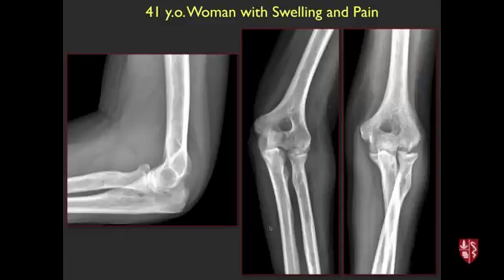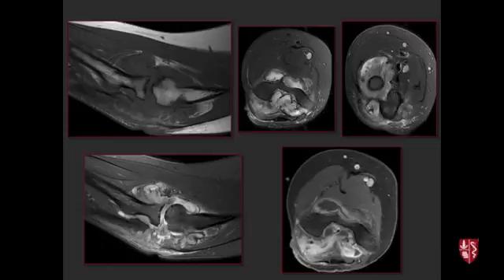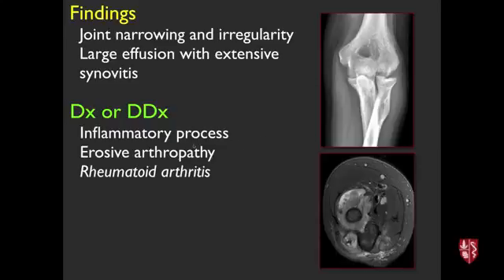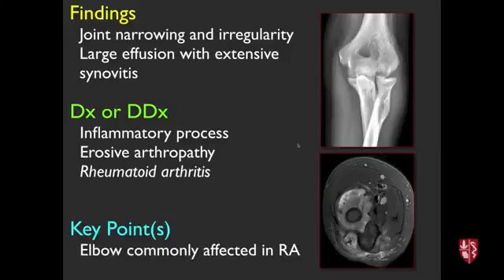Next case, 41-year-old with swelling and pain in the elbow. Radiographs show irregularities; MRI shows radiocapitellar joint fluid and extensive synovitis — an inflammatory or erosive arthropathy. This is rheumatoid arthritis, which is fairly common in the elbow. Extensive RA with synovitis.